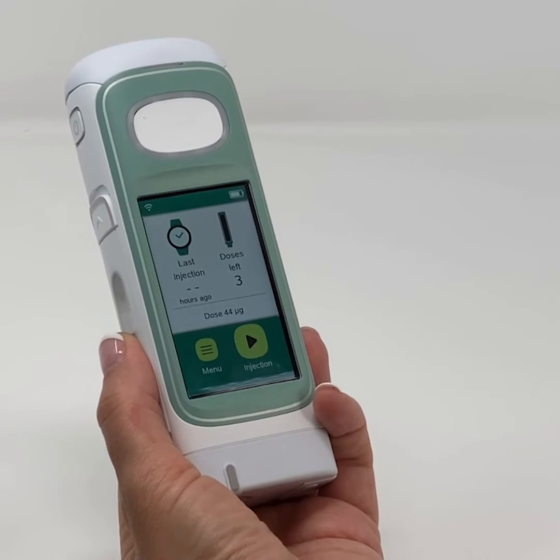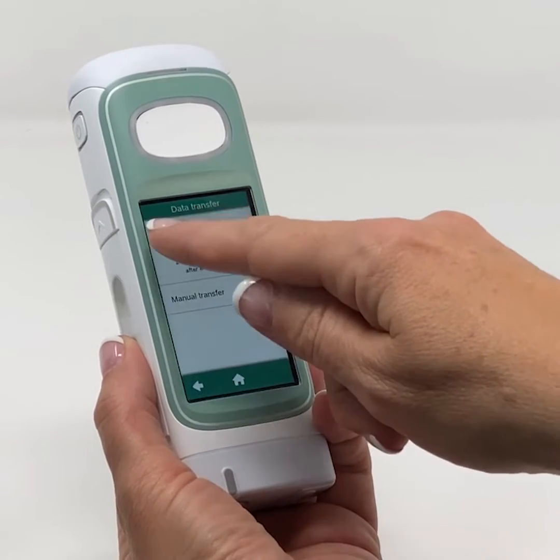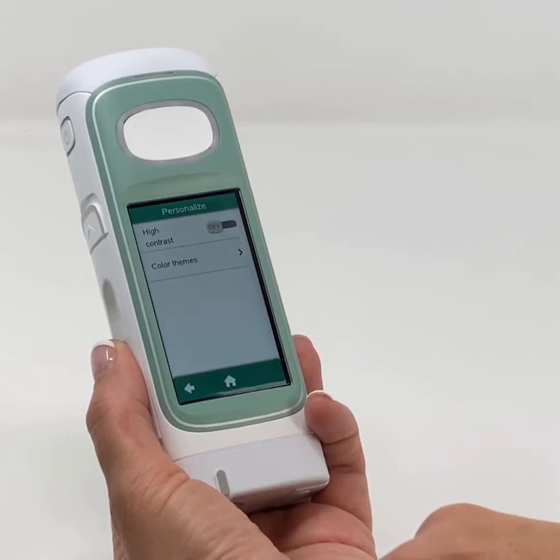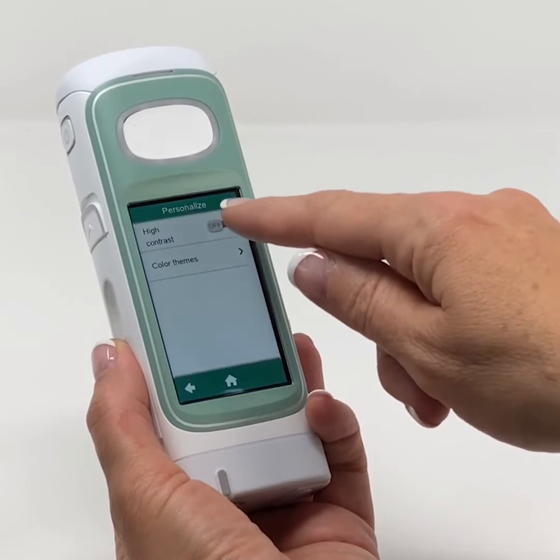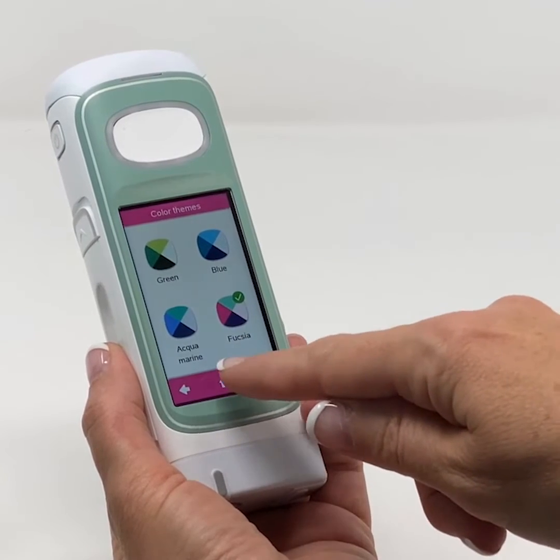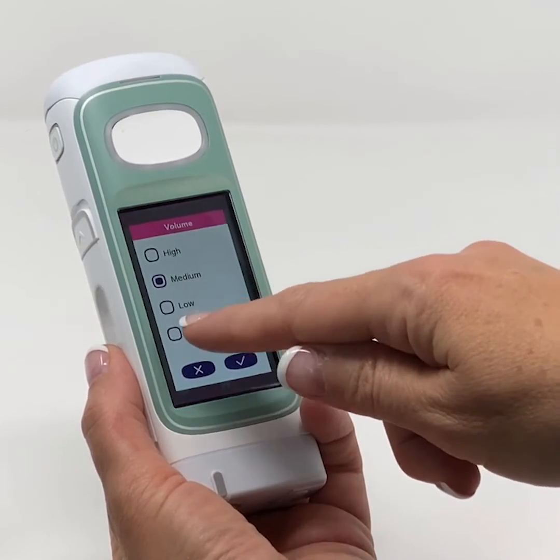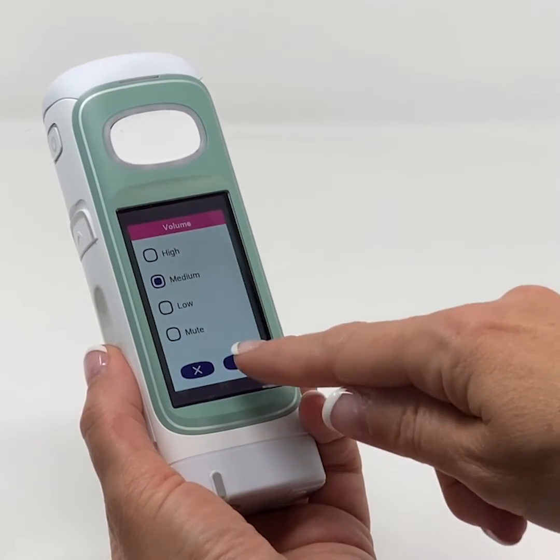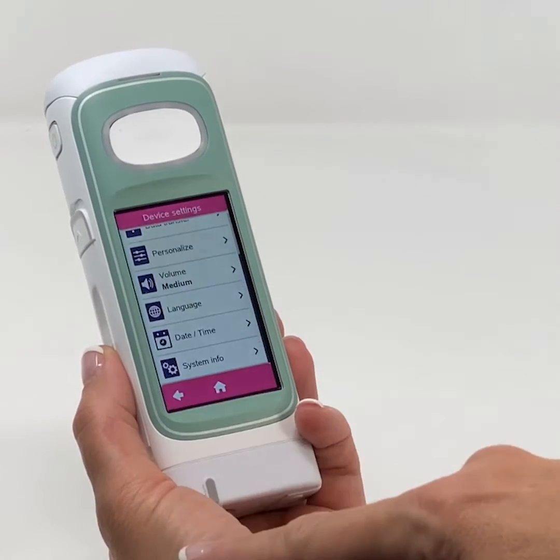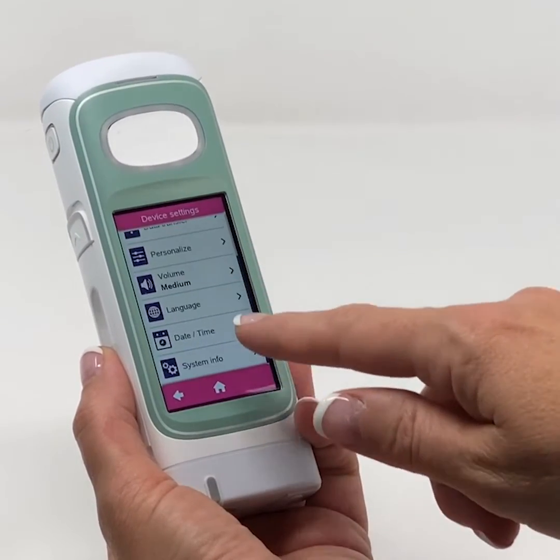To set the device settings, go to the menu and click Device Settings. You can turn data transfer on or off and confirm. You can personalize the device with a high contrast mode and different color themes. There is a volume control with high, medium, low, or mute options — tap to confirm. There is also a language option, a date and time format setting, and a screen that provides system info.